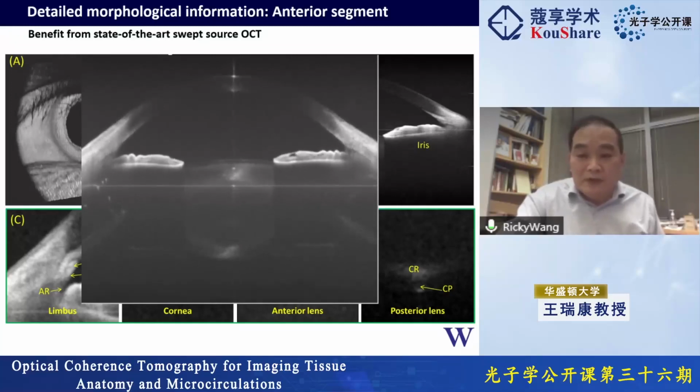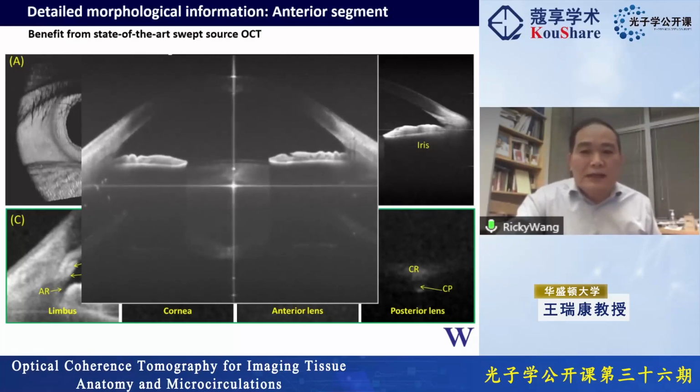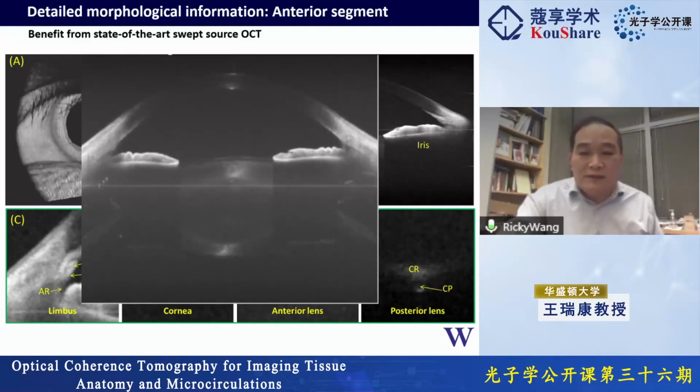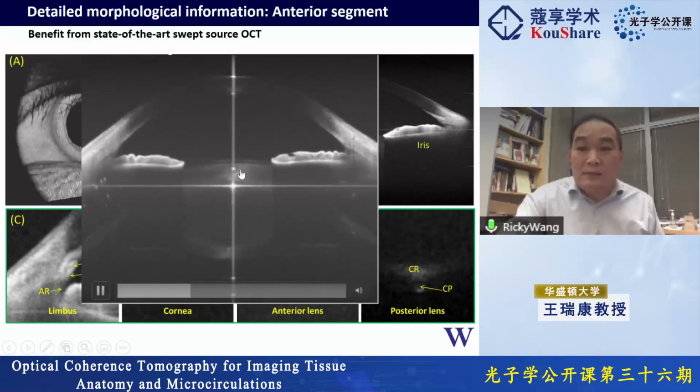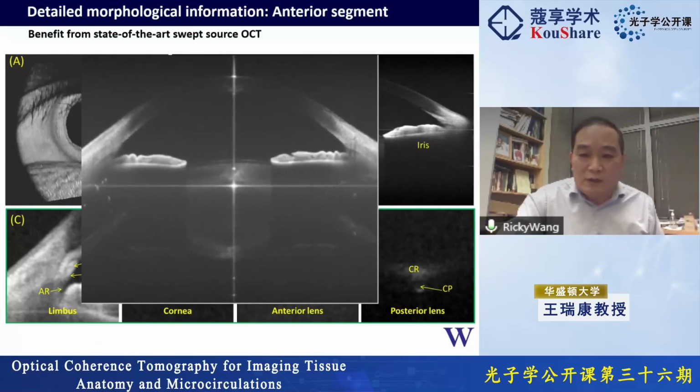And this is really important for looking at glaucoma, and also, more importantly, I think in China, it's really a huge problem, myopia, right? So in this case, you can look at myopia as well. And there's a very small part at this corner over here, a machine or organ called the trabecular meshwork.